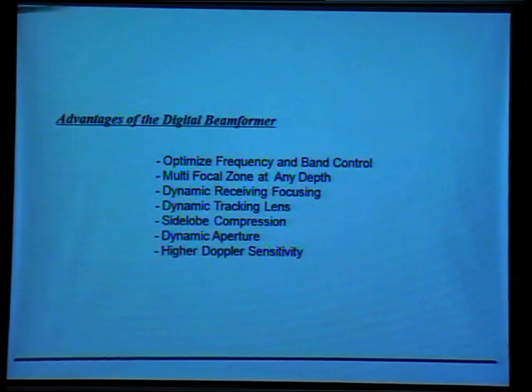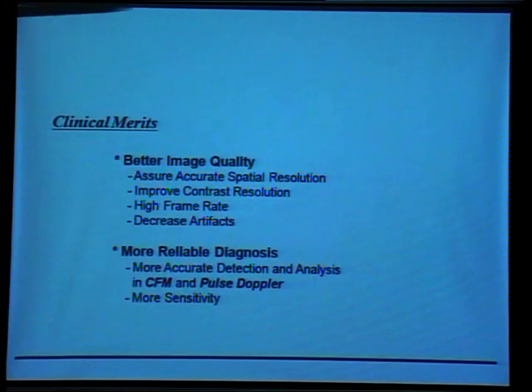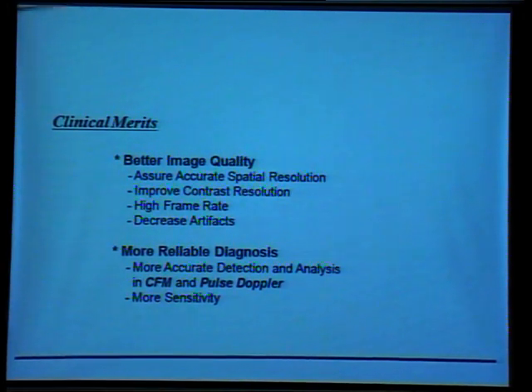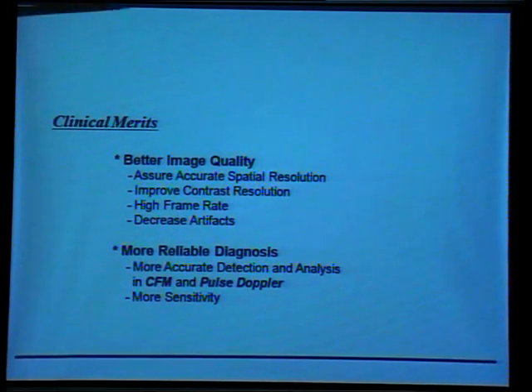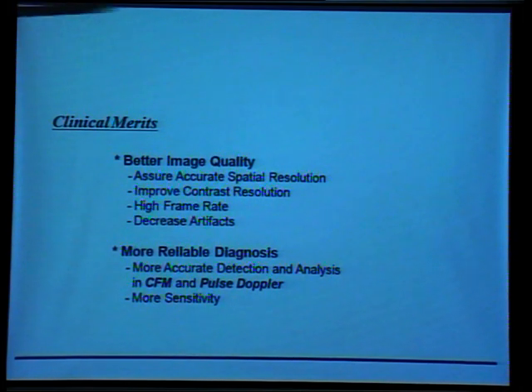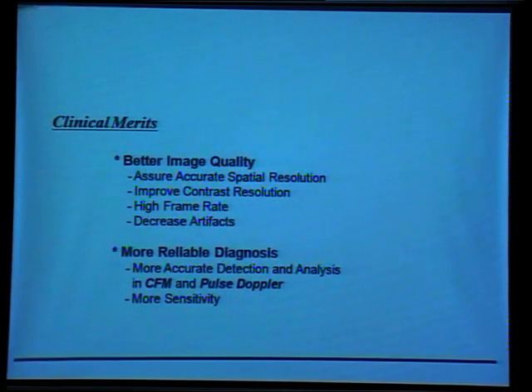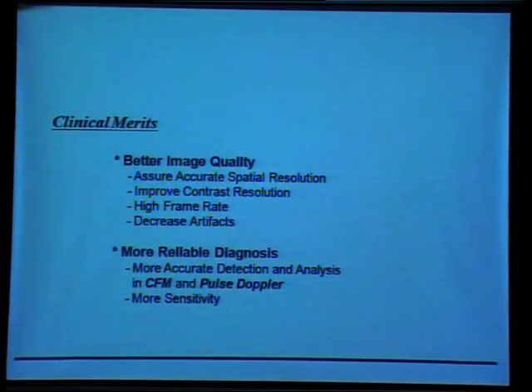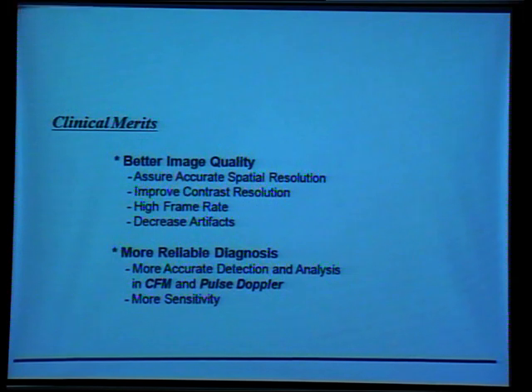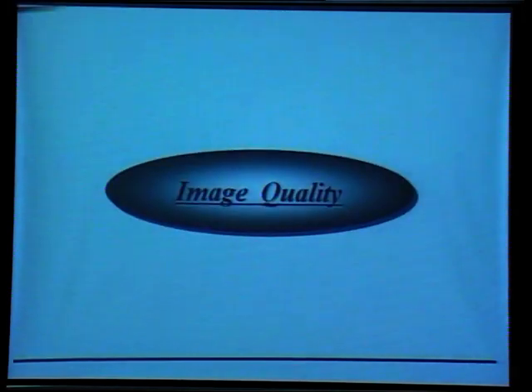So some of the advantages, I'm sure you know what are the advantages of a digital beamformer. They are not just ultrasound specific; they do other things as well. Clinically, right now you may be more interested from the technology point of view. But as I said, when you move out, try to become a little bit of doctors as well. When you interact with the medical community, if you don't speak the doctor's language, if you don't speak the clinical language, you become a normal English-speaking person. You should understand those things.